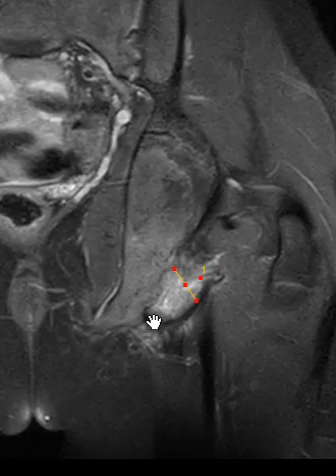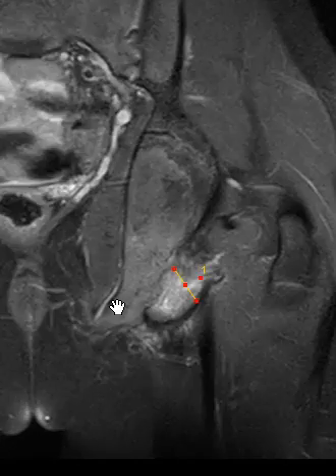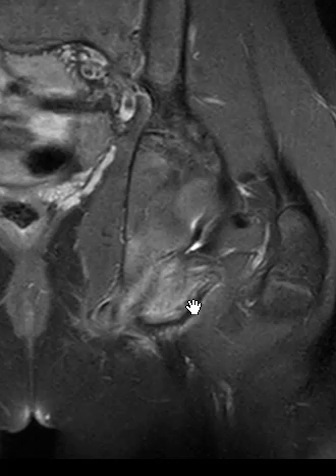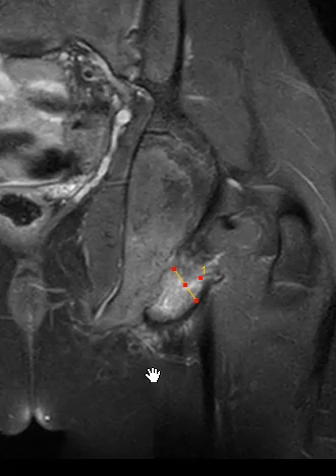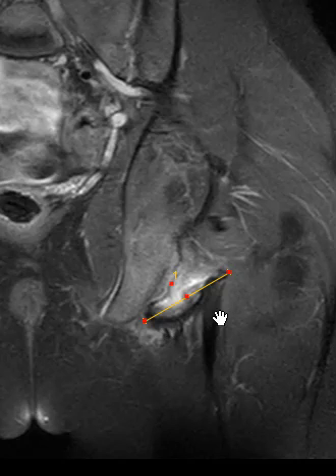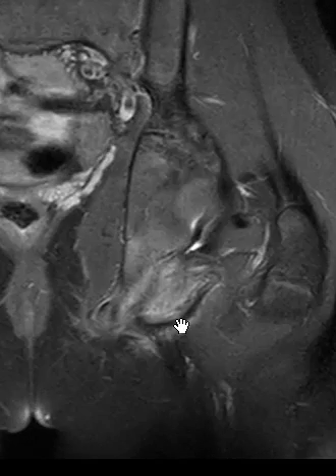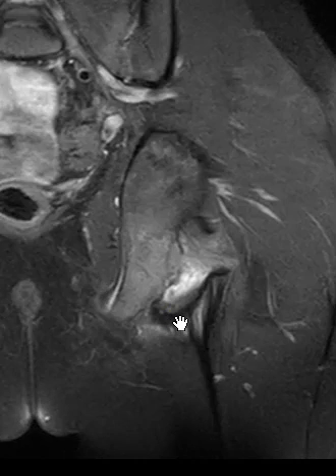This is the apophysis of the ischium — so this is the ischium coming down here and the apophysis is fractured and distracted. Usually the apophysis is distracted distally, but this one for some reason is distracted laterally. So this is a fracture of the left ischial apophysis. The hamstring tendons come up and attach fine here on the fragment, but the fragment itself is distracted laterally.